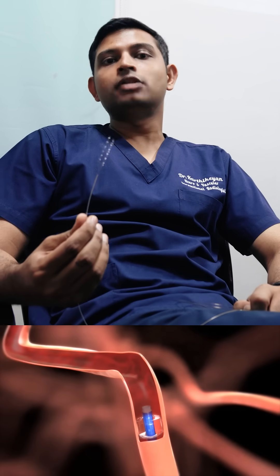Once the brain gets back its normal blood supply, the patient has a good chance of recovering from the clot.